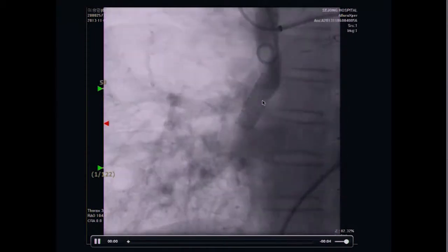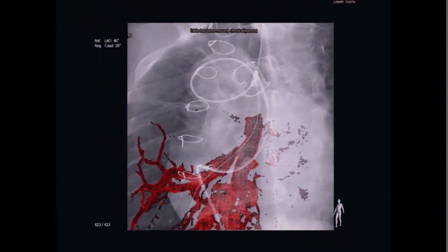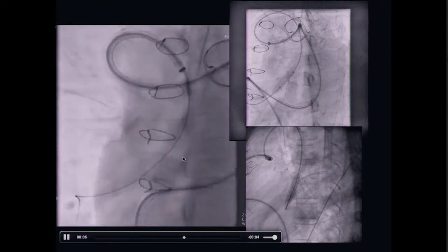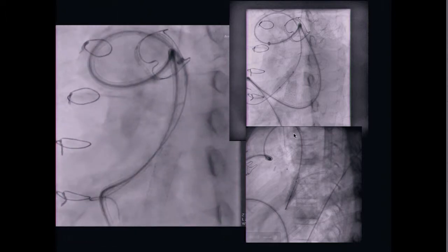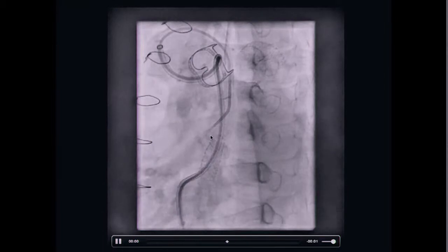Because of the long course of the RPA, if we had not used the rotational angiogram it may have been very difficult to intervene. But as I showed before, I could easily select this stenotic vessel with a 3D roadmap, confirm this artery by rotating the camera, and perform balloon angioplasty easily with a good result. I could identify the stent origin, which may have contributed to the stenosis, and after checking it we could find the opening in the stent.